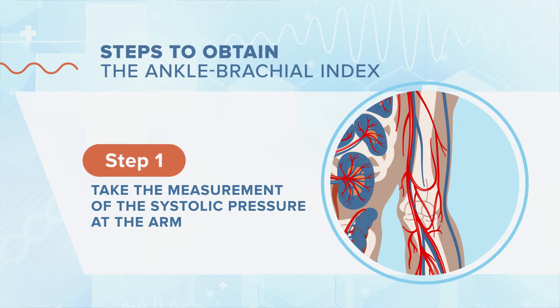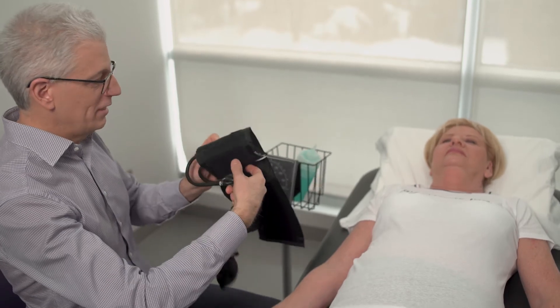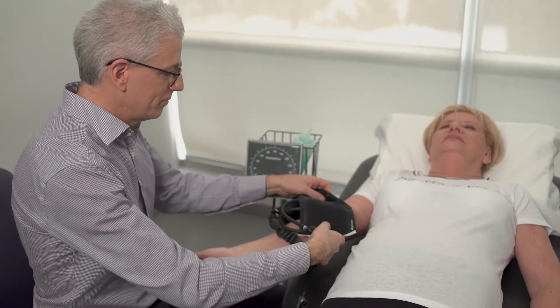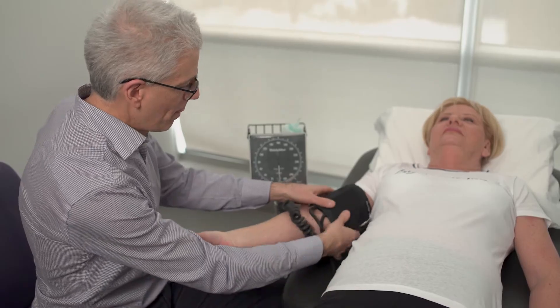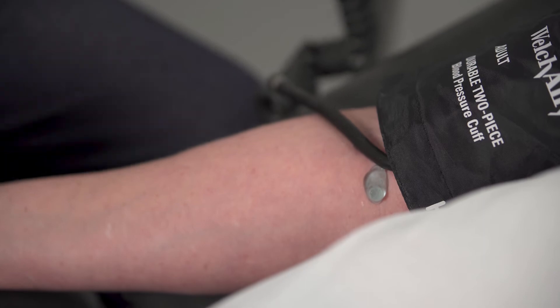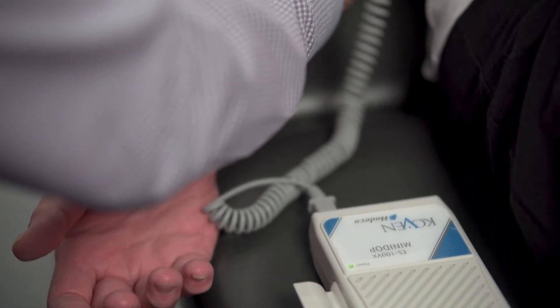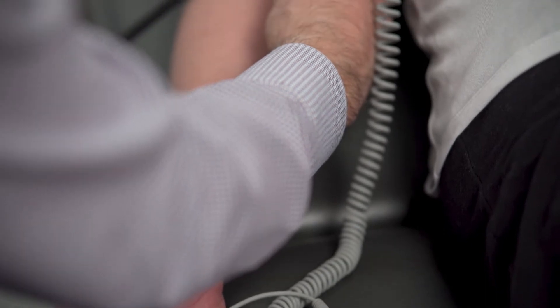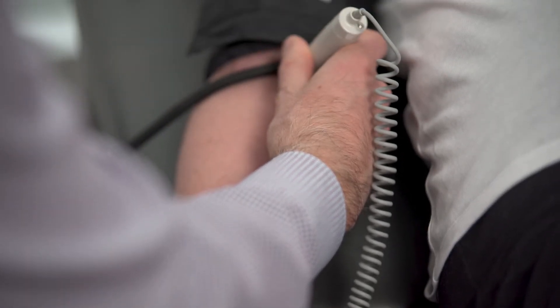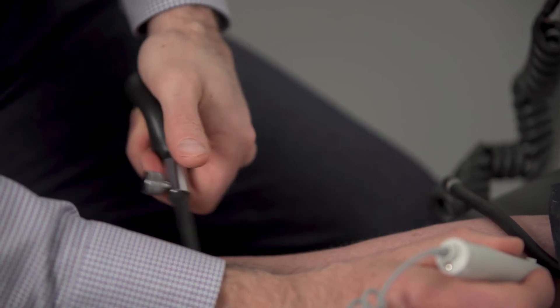The first step is to take the measurement of a systolic pressure at the arm. The blood pressure cuff must be placed around the arm and the fingers are on the brachial artery. We have to put some ultrasound gel right here in the antecubital fossa over the brachial artery. Now we can listen for the signal with the NL Doppler. We are hearing a normal triphasic pulse. When we inflate the blood pressure cuff, we no longer hear a signal.